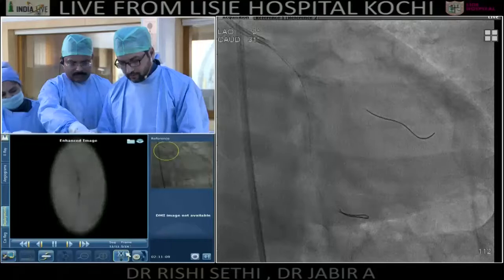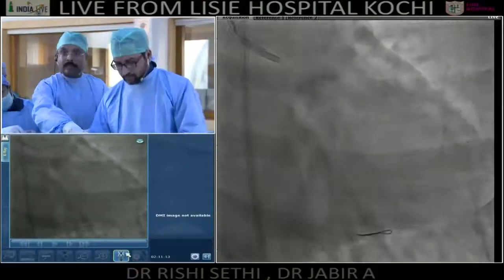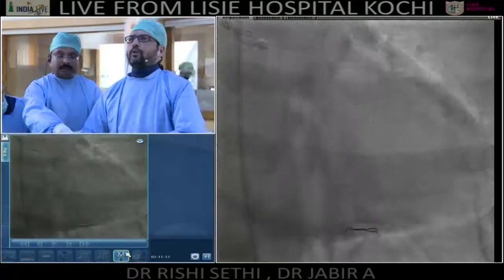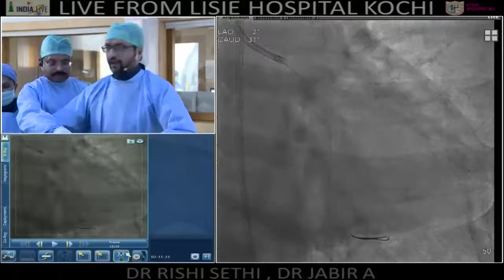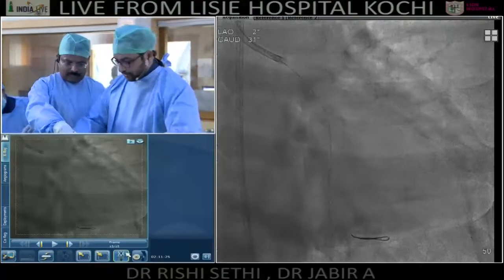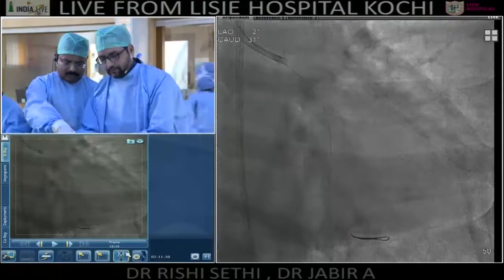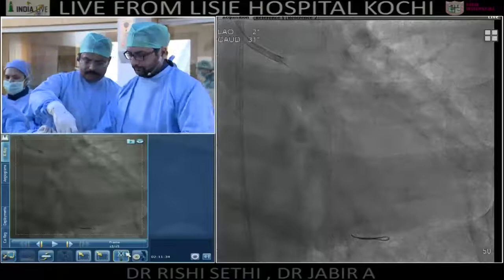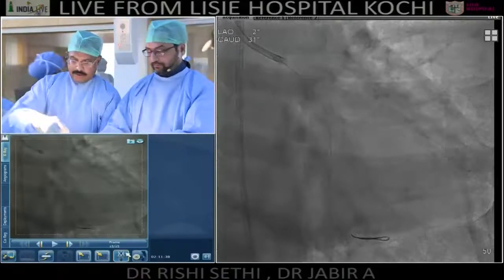You'll do an IFR first? That way it's shorter, no? No adenosine and all that. Let that wire come out. Yeah. So it's the same wire that you can use for FFR and IFR. Yeah, that's true. But then you get it quicker. The beauty. So we'll do an IFR first, because your IFR was 0.87 as you said last time. Okay, give the wire.